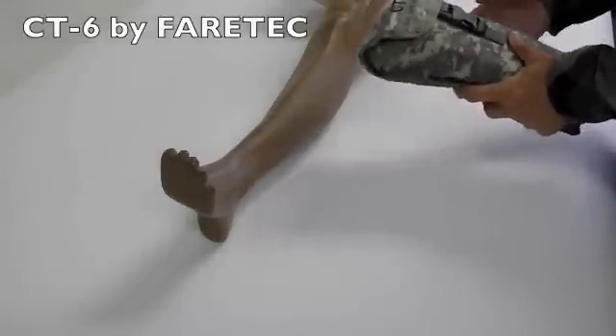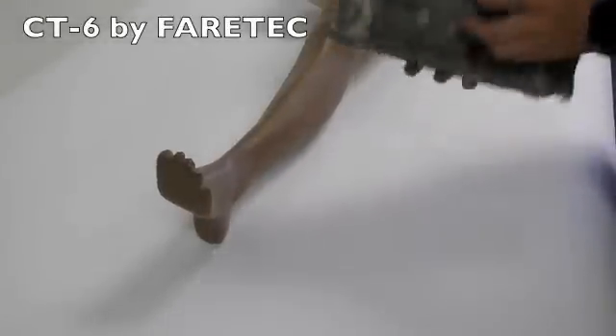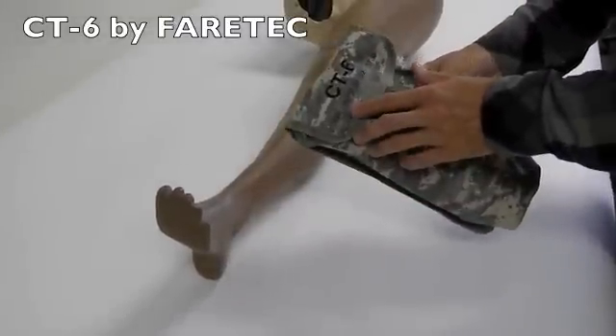Here we have the CT6 by Fairtec. It's in its military style bag with an NSN number on the front.